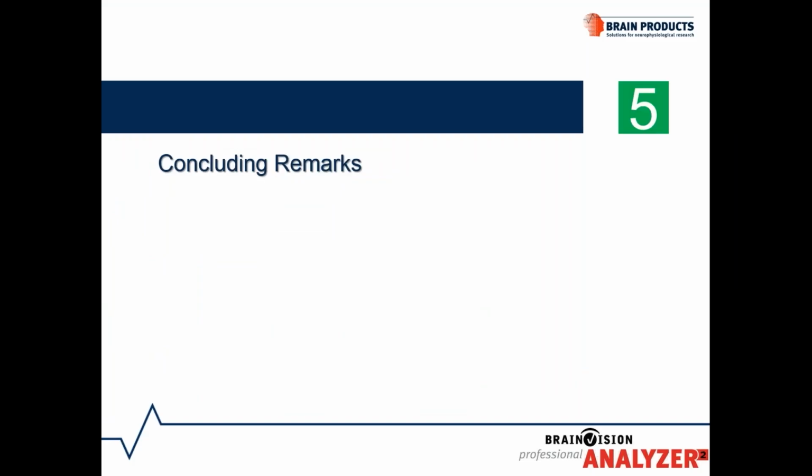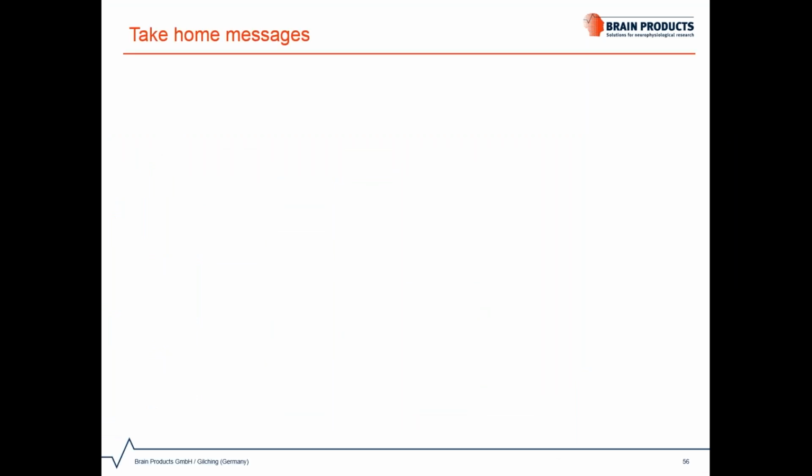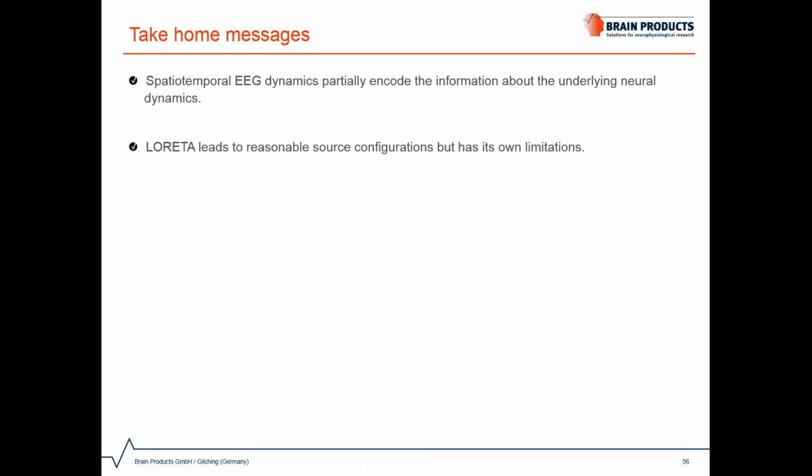and give you some concluding remarks to recap what we have been discussing in today's webinar. So the important take-home messages are the following. The spatiotemporal EEG dynamics partially encode the information about the underlying neural dynamics. LORETA provides a reasonable source configuration, although it has its own limitations.